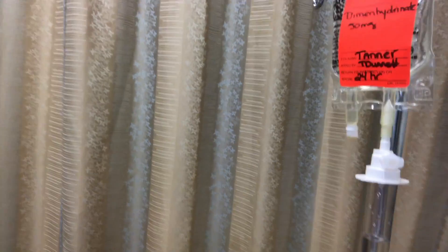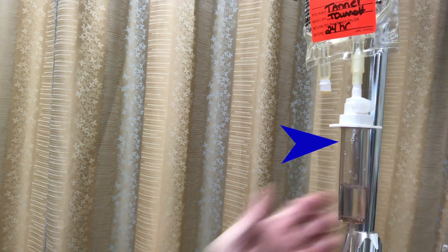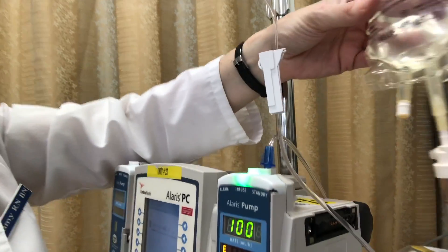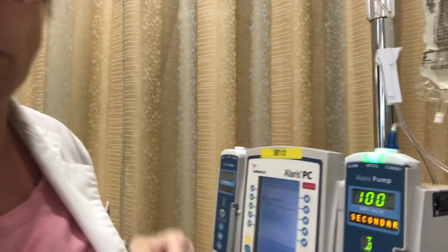Now what we should be noticing is that there are in fact drops coming into this chamber, and no drops in this chamber, because my pump is taking it from the correct bag. That's your secondary bag all done.